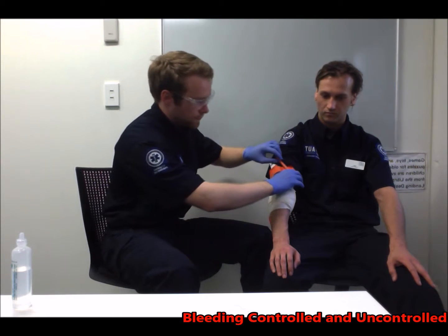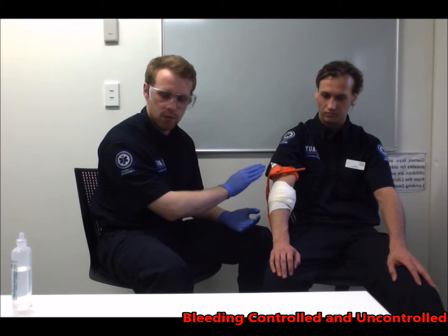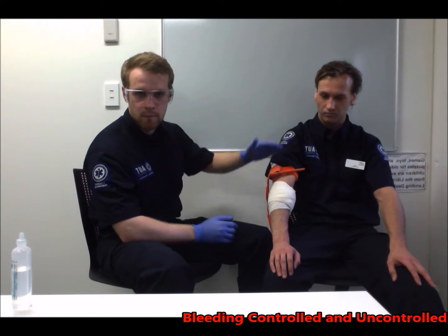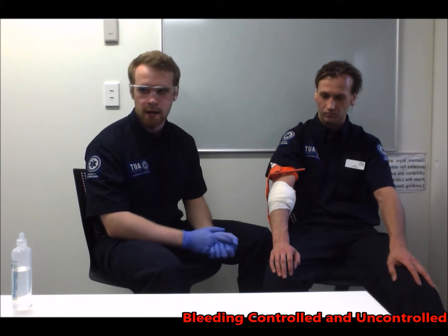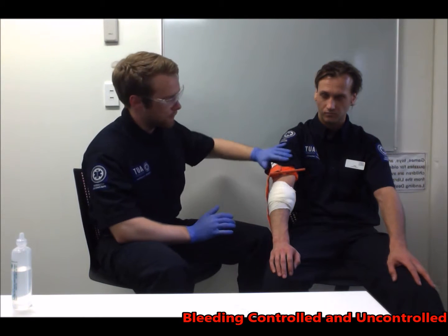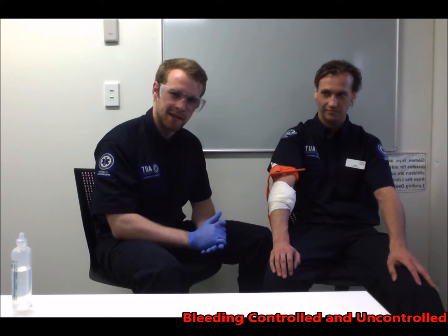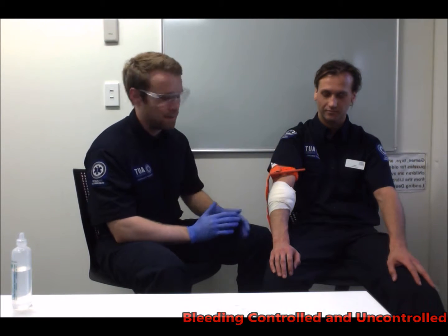If however this one tourniquet does not work, you can always apply another one proximal to this one. Once the tourniquet has been applied, it should be uncovered and not removed. Also, you want to document the time that you apply the tourniquets.